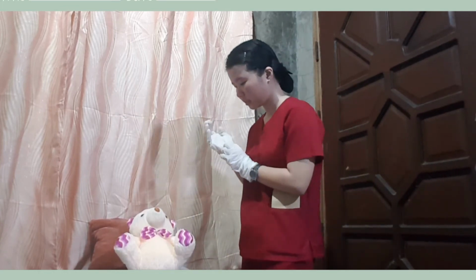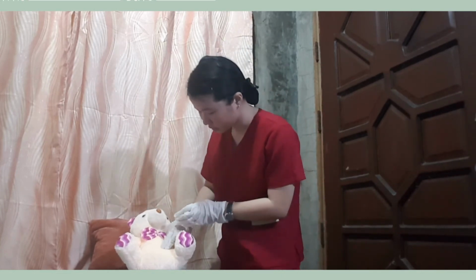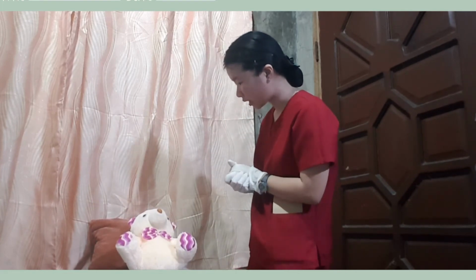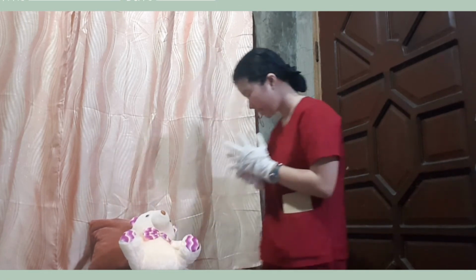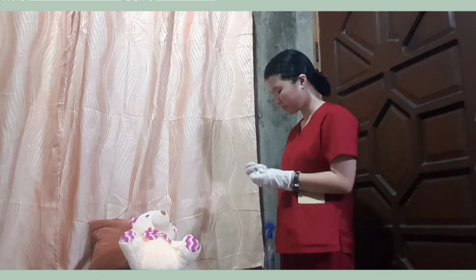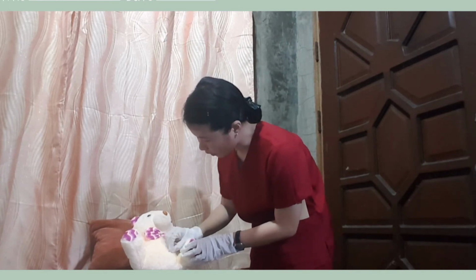And after doing this, we need to proceed to procedure number 20, which is to select the site, which is on the abdomen, and disinfect the site. So we're going to choose it here, on this site. Ma'am, asa ka last time di-injectan sa imong shot, ma'am? Sa tikas. Sige, dili ata sa tikas side karon. So, this side. Disinfect with the alcohol swab. From center to outer.